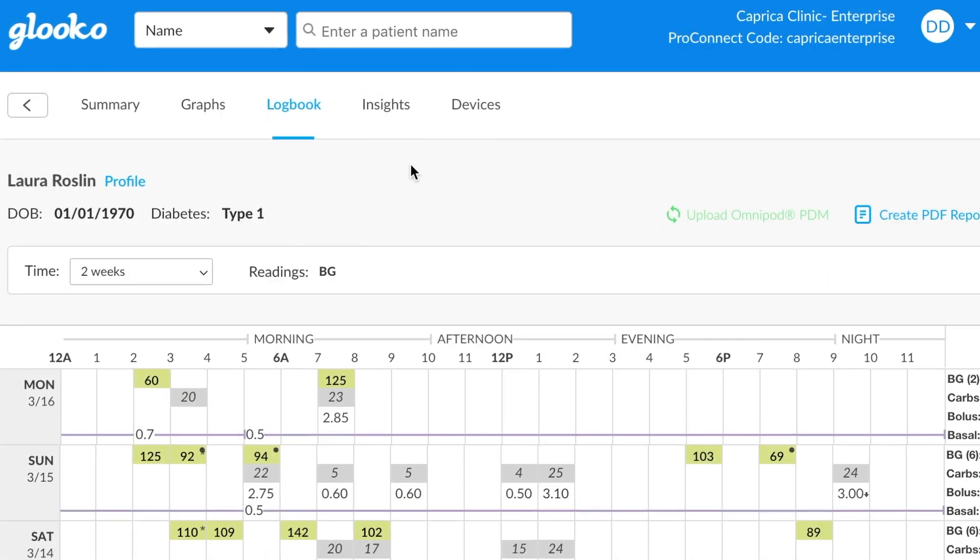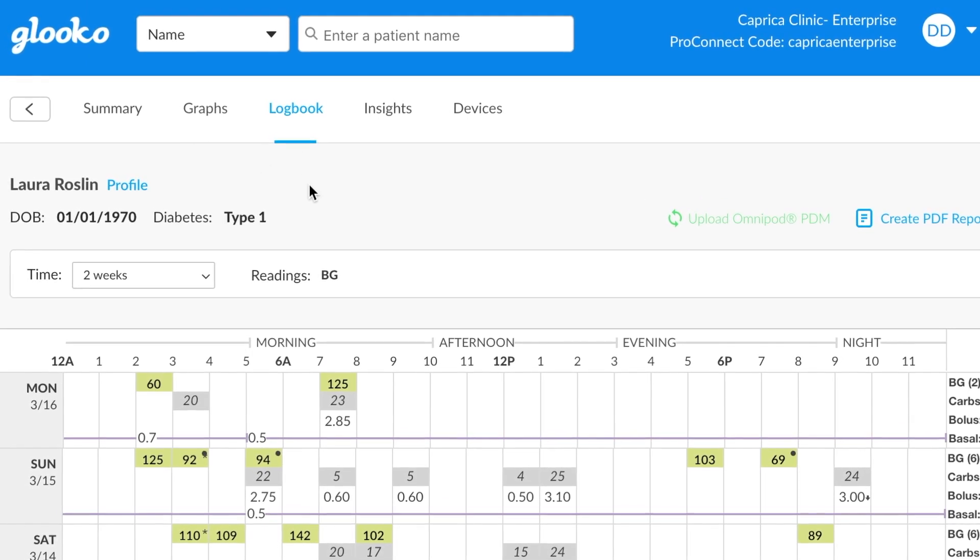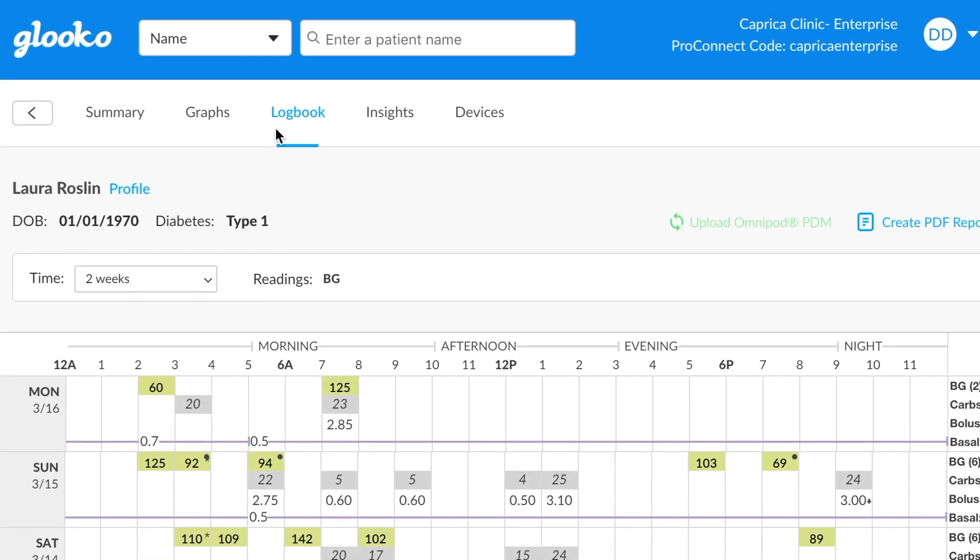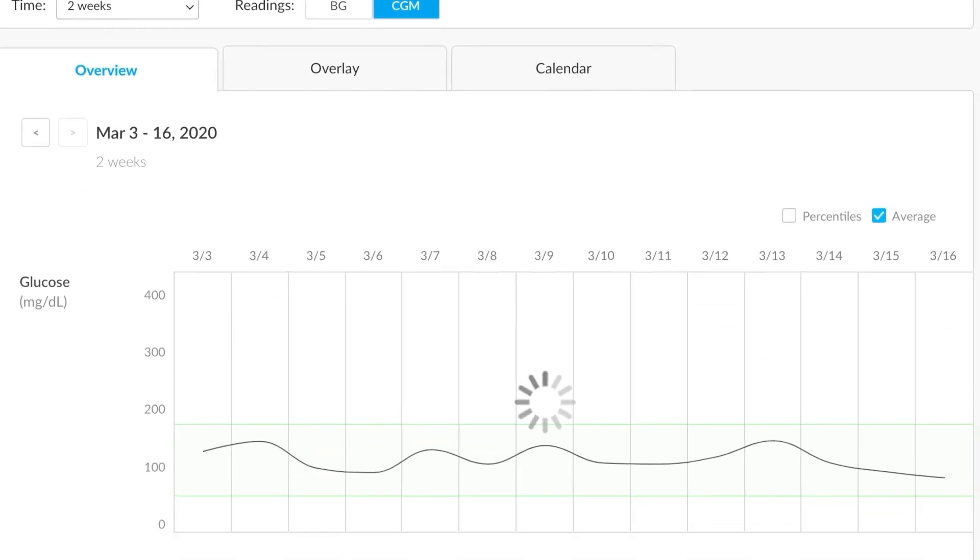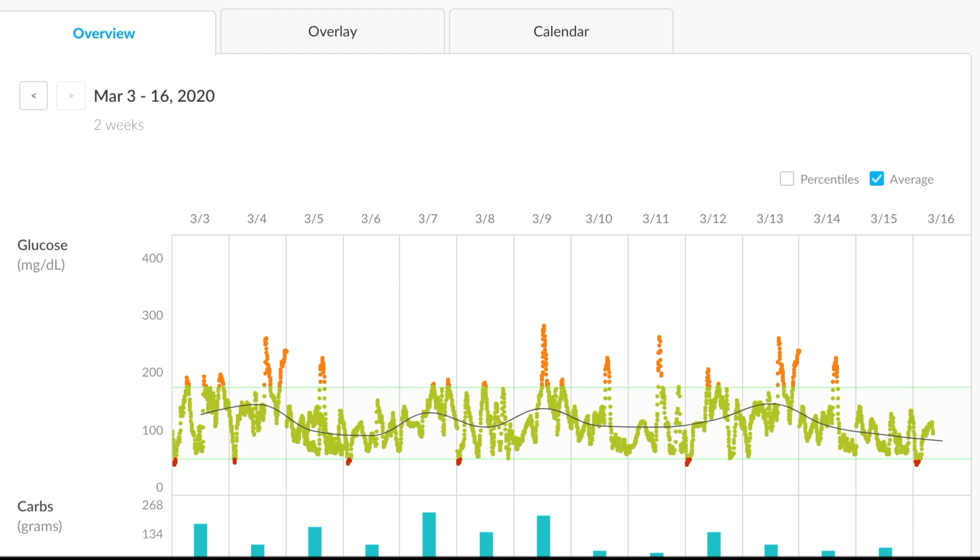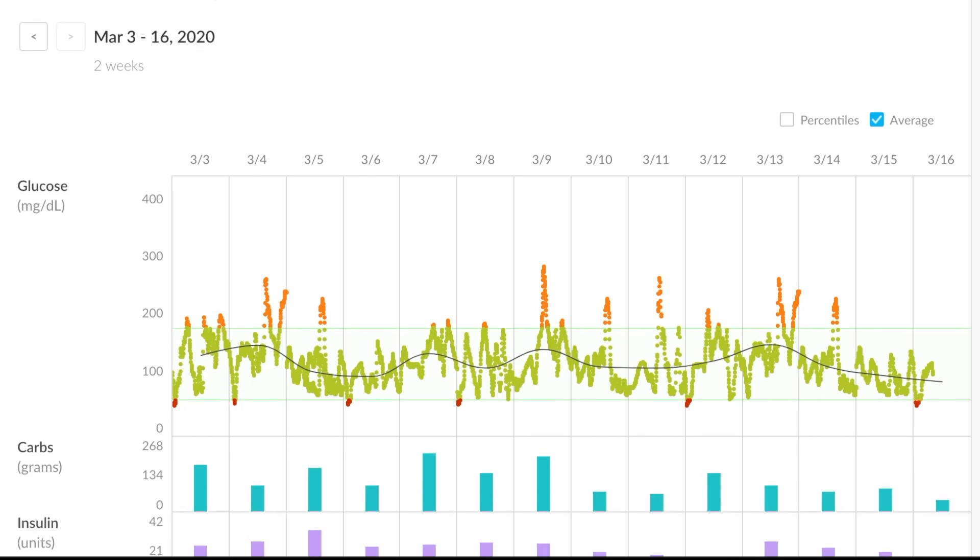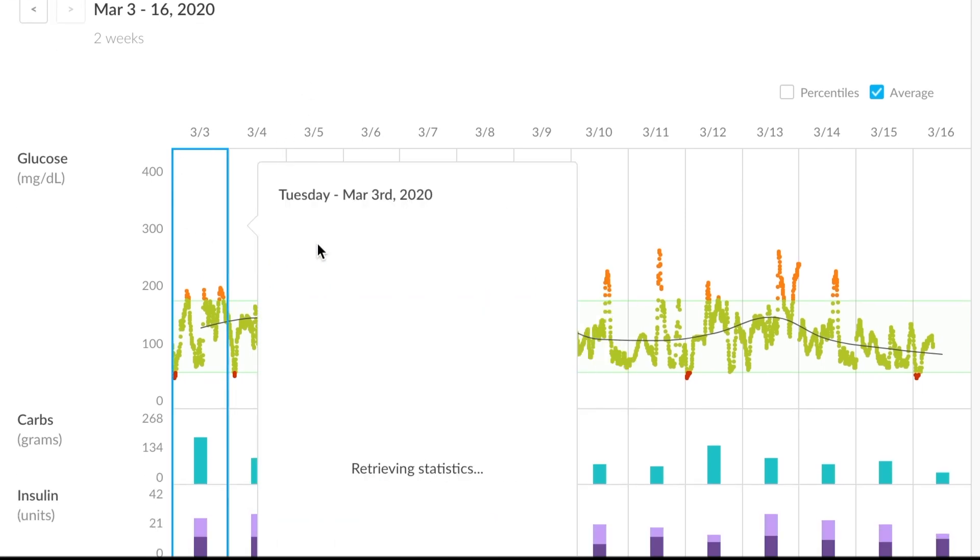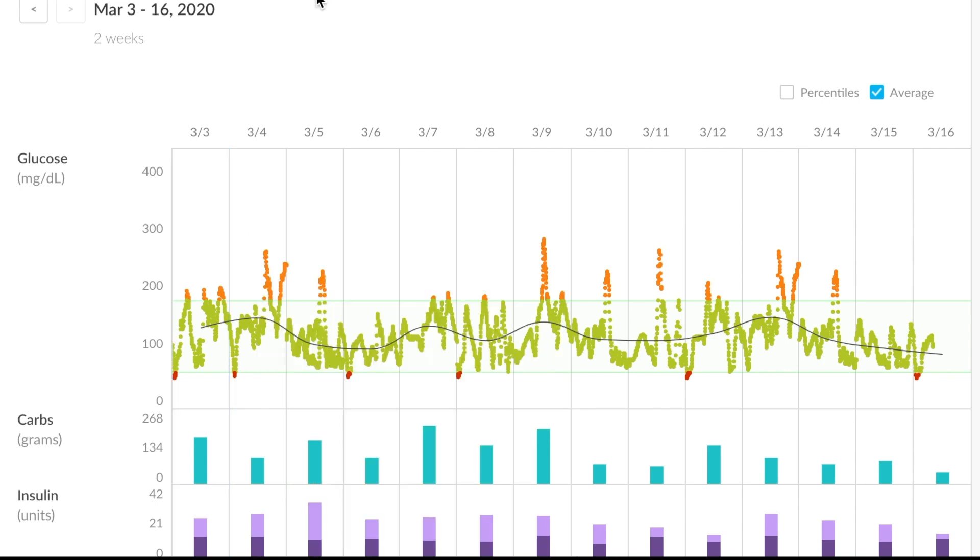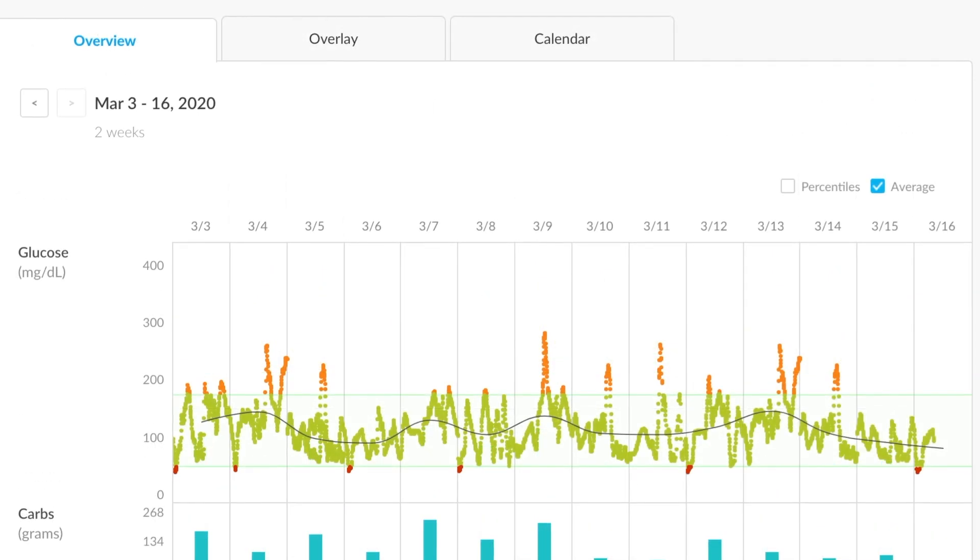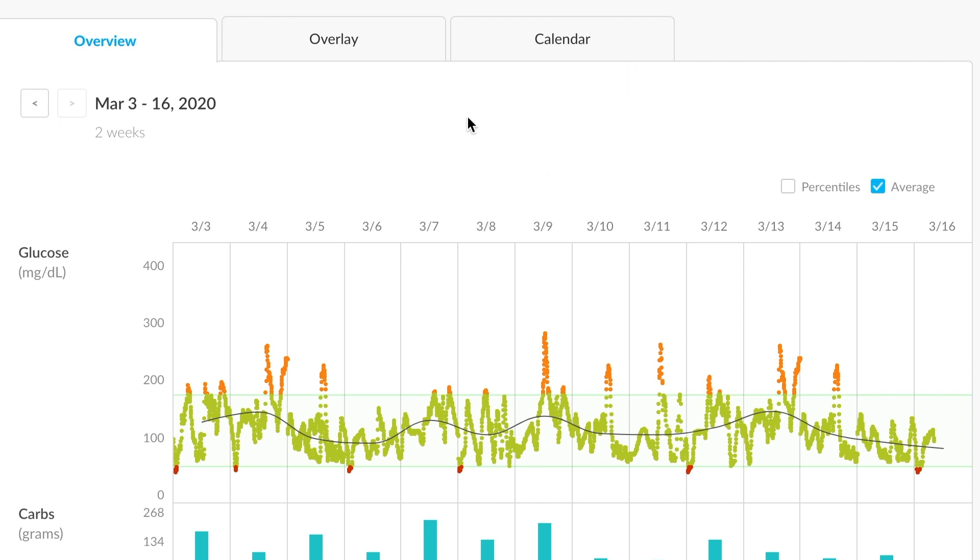Another useful view that we have available on gluco is this graphs section. So if we click into that, you'll see that it gives us more of a graphical representation of the information. You'll find a lot of the continuous glucose monitors, the CGMs of the world displayed here, and it gives us a better indication of long-term trends and data over time. Within the graphs section, there are a few subsections here, overview, overlay, and calendar, each of which give you a different representation of the data.